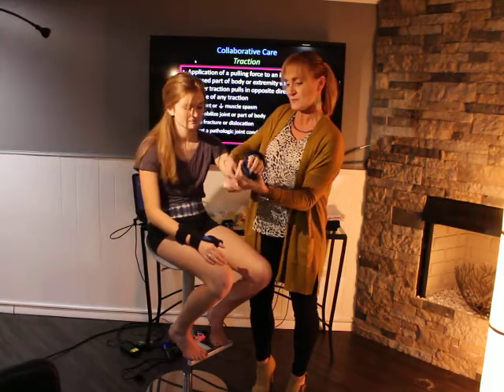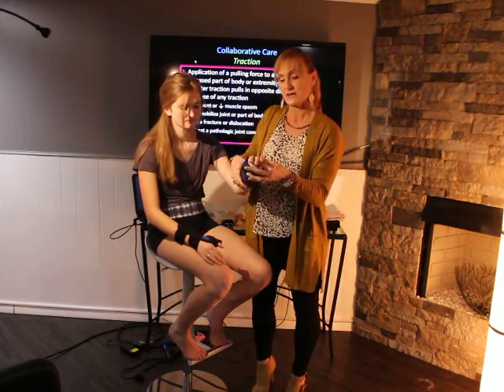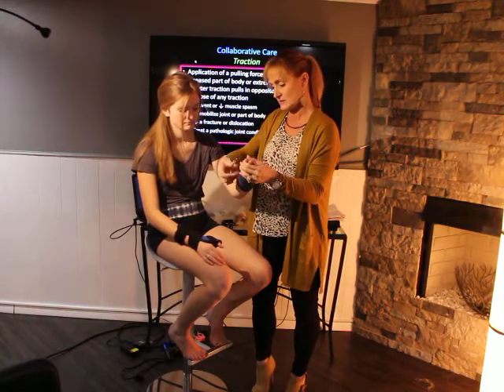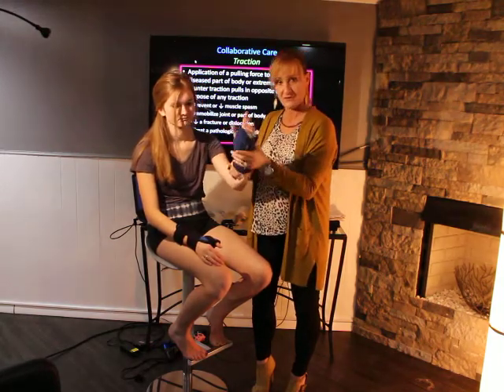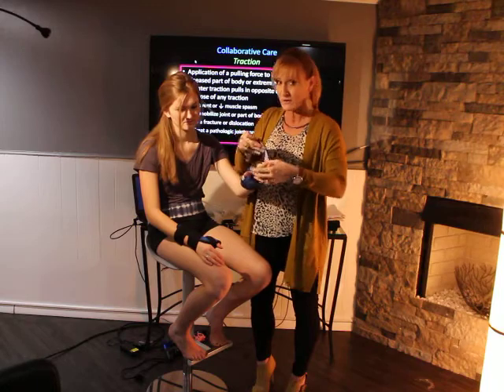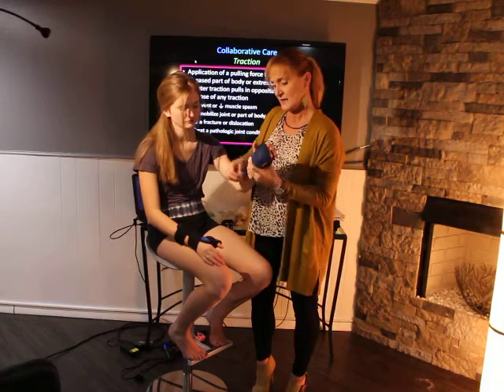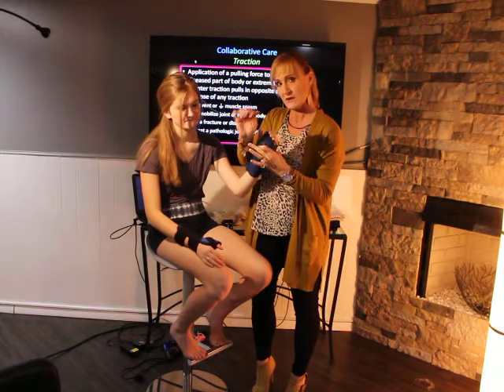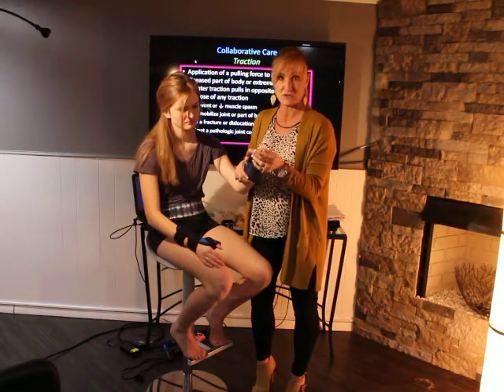Then again, you're just going to wrap this around, snug, but not so tight that you are cutting off circulation. And again, you don't want it so loose. If I just did this nice and loose like this, now your patient can move their hand around in there, and you've not compressed enough to keep the inflammation down. That's the whole point of the compression, is to help keep that inflammation down. So you want it nice and snug, and in this case, because you've got this band right across the radial artery and the ulnar artery, you're going to want to make sure that those fingers are staying nice and warm. You're going to want to make sure that they're not getting purple.